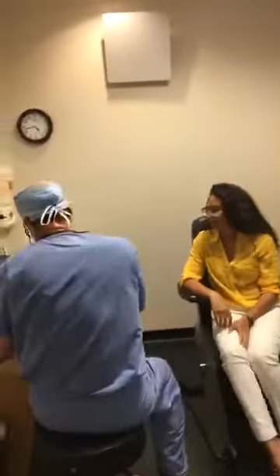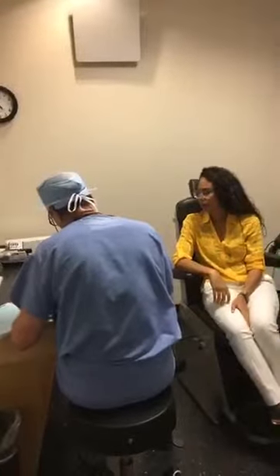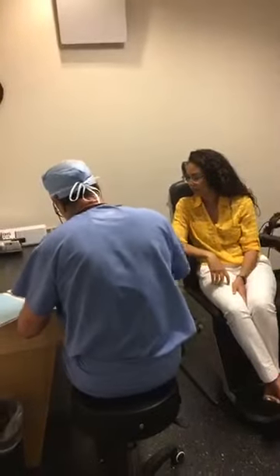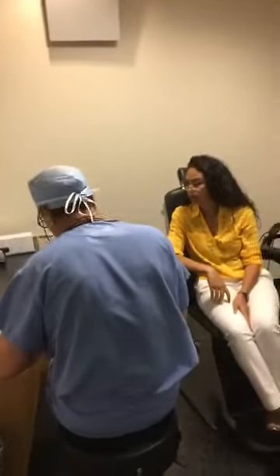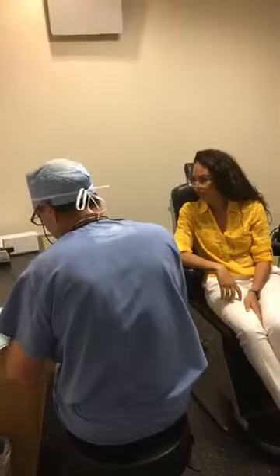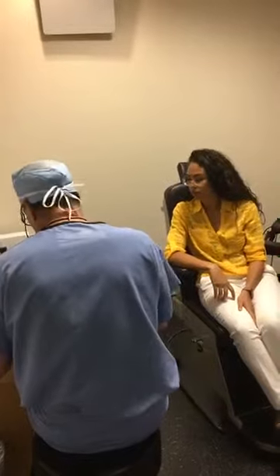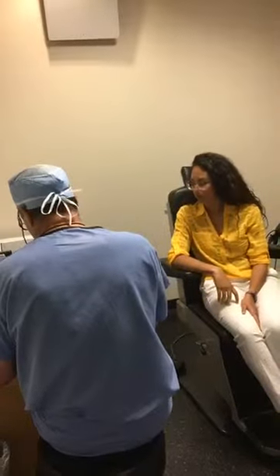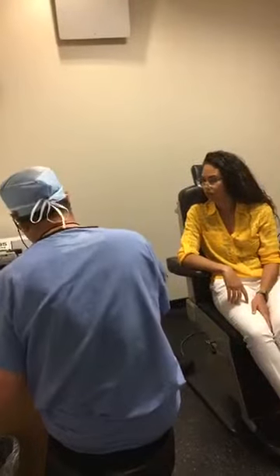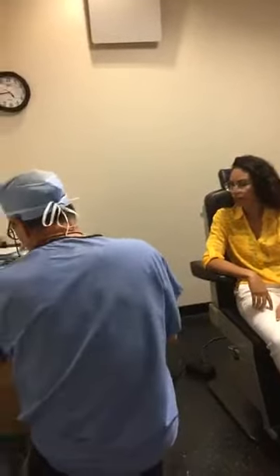Good. I'm just looking at your maps here, which are good. It shows that you have really good corneal thickness and just the right amount of curvature, and that you don't have any underlying corneal conditions such as the ones I went over in the video, like keratoconus or any unusual thinning or an unusual shape or configuration to your cornea. So your maps are good and your thickness is good. Your amount of nearsightedness is perfect.